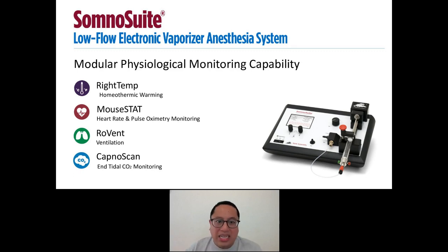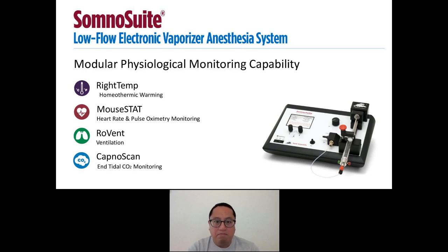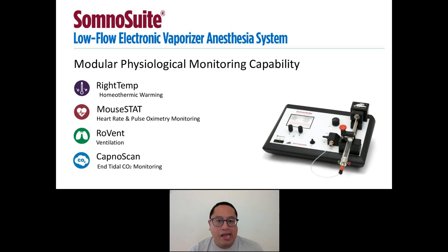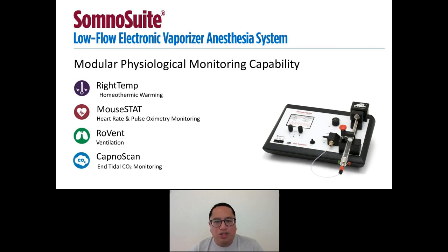The RightTemp module is for homeothermic warming and it is included with the SomnoSuite at no additional cost. The Mousestat module is used for heart rate and pulse oximetry. The RoVent module is for ventilation and the CapnoScan module is used for end tidal CO2 monitoring. So depending on your needs, you can add as many or as little of these modules as you want, making the SomnoSuite a pretty nifty all-in-one tool for you.